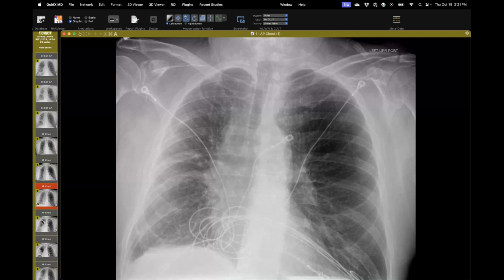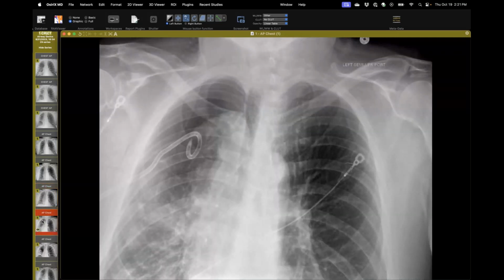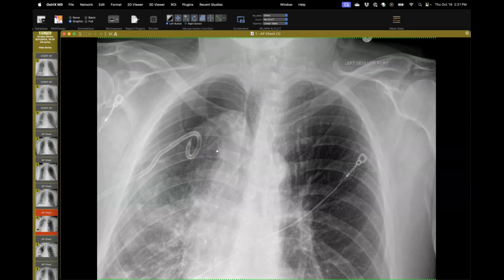And then he developed a pneumothorax, which does happen. You can see that they put a drain in there. Sometimes these persist, and I wonder if a component of this is ex vacuo, because you really haven't violated the pleura, but rather you've caused a rapid collapse. We reported this as ex vacuo. They put a tube in anyway, and it's been percolating along for some time.